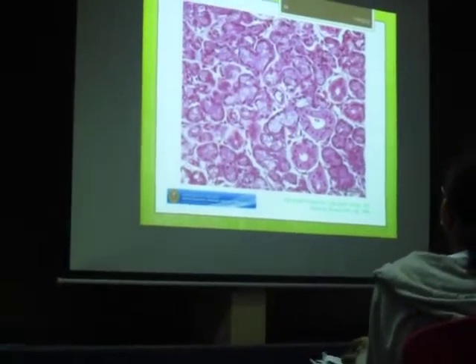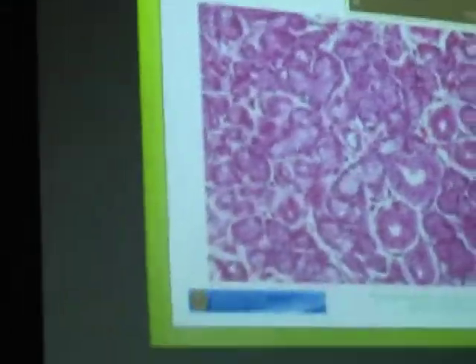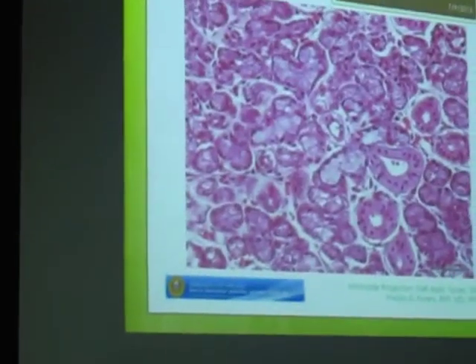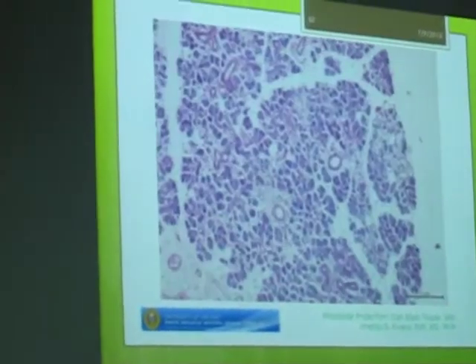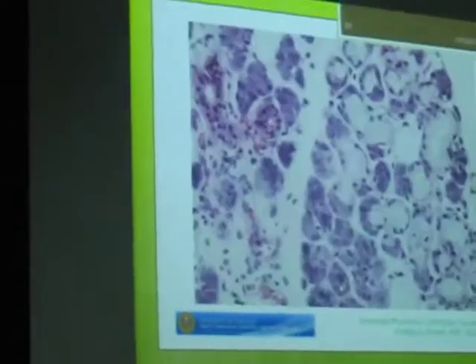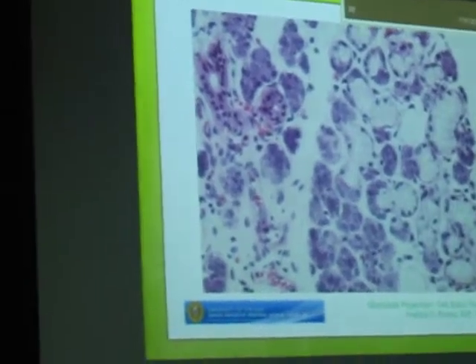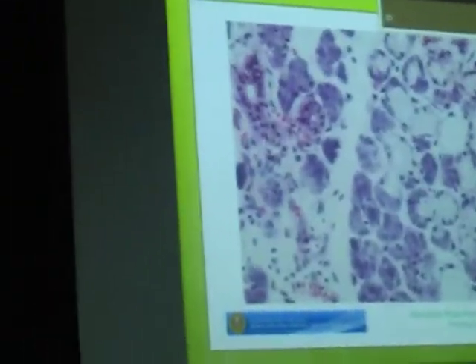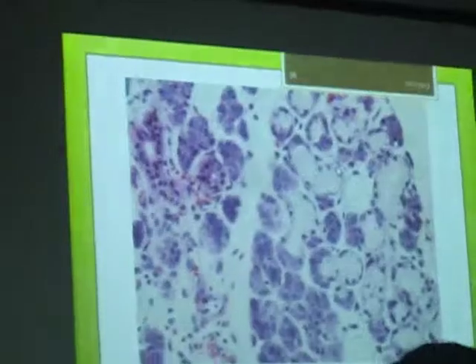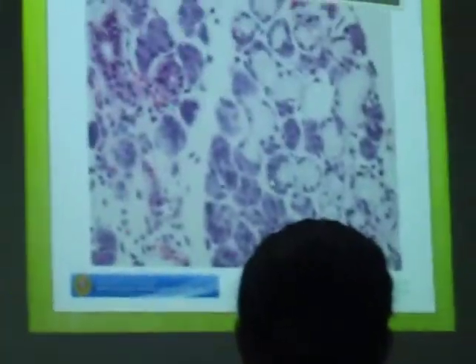Moon or lunar. So, demi-lune. Okay, so this is a mixed gland according to the type of secretion. Okay, this is another section, a different slide of the same organ, submandibular gland, showing you mixed acinus with serous demi-lune.